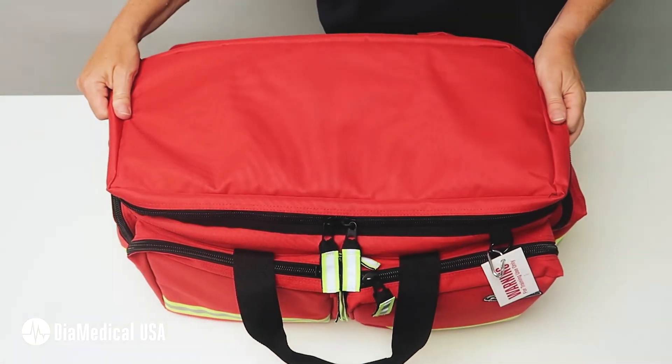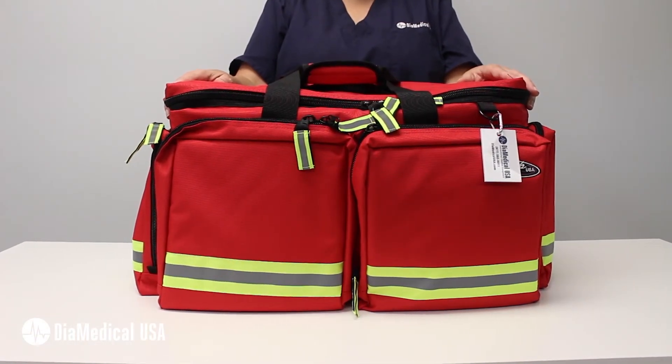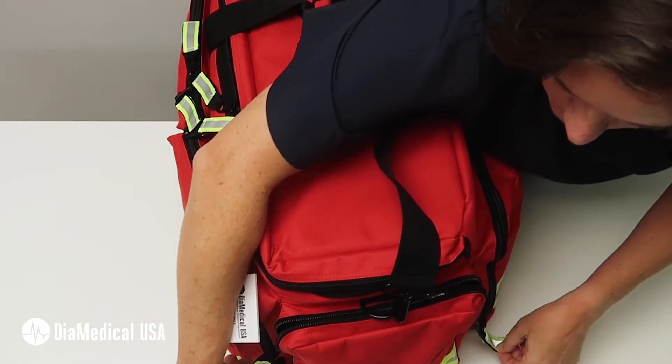The ALS Loaded Jump Bag is made from durable nylon with a reflective white stripe all the way around the bag for high visibility. It has many pockets and compartments so that all of the supplies arrive neatly organized and ready to use.